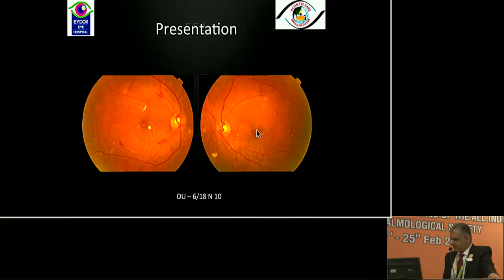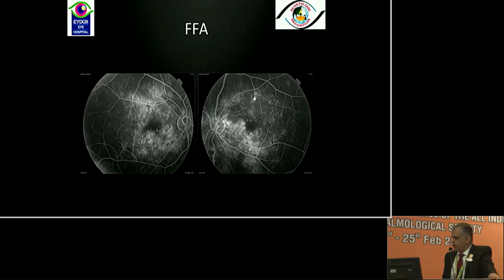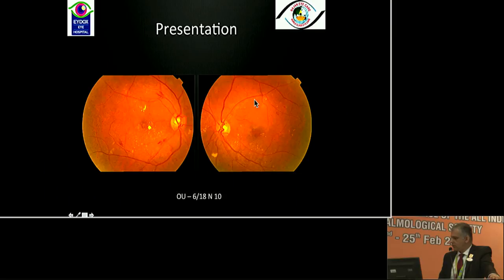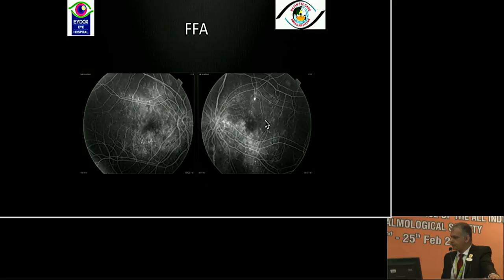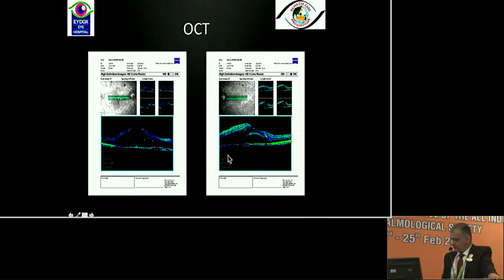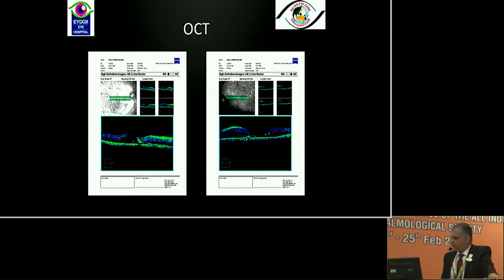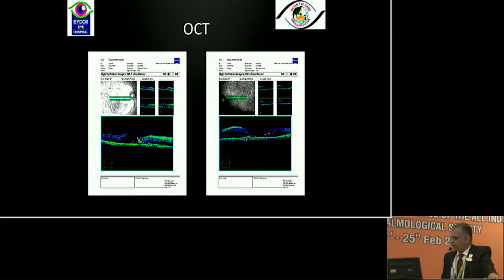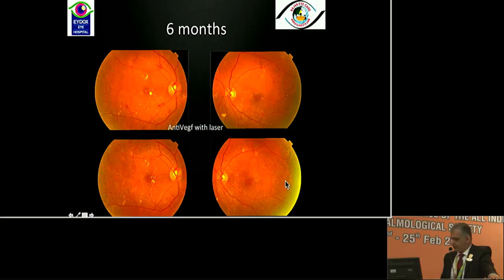How do we apply these principles? We have one patient with bilateral visually significant diabetic macular edema with fairly good vision. On angiogram we see multiple leaks, and this patient also has a CSR-type leak — not only diabetic macular edema. This subtle finding was missed on clinical examination, but when I did a baseline angiogram I picked up the CSR. After intensive control of diabetes, post-treatment with anti-VEGF and laser, over a period of time with persistence of treatment, we see a clean-looking retina with edema resolved and good visual acuity for this patient.